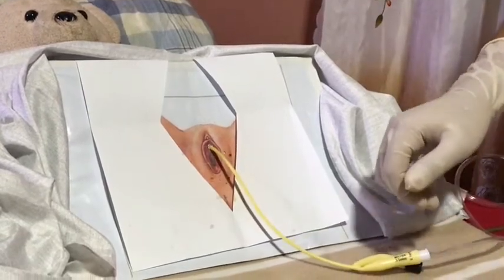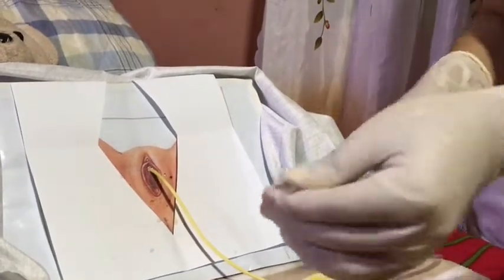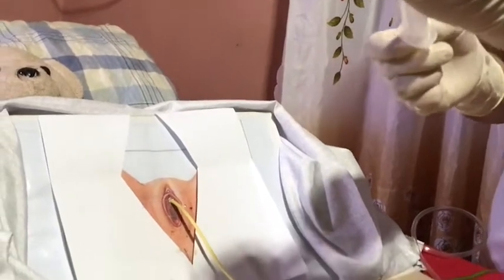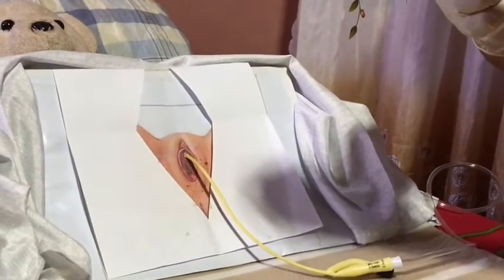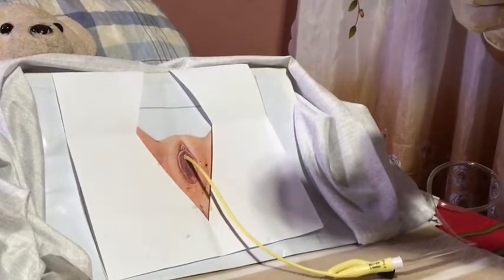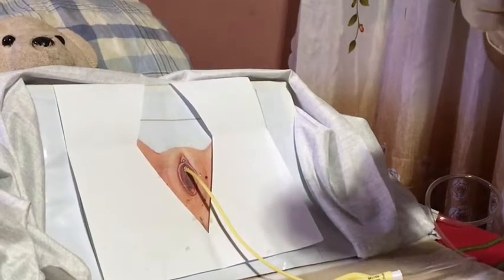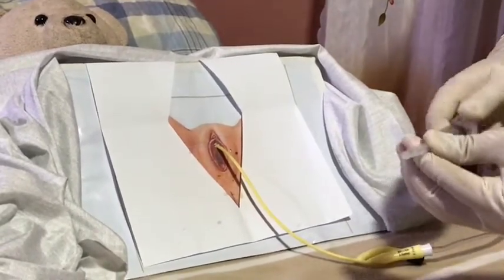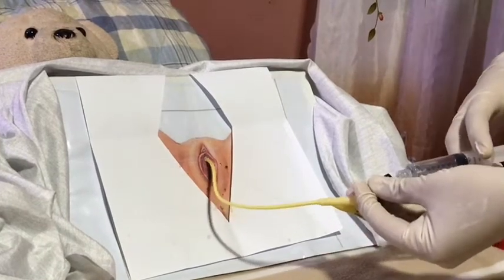Now inflate the balloon using 10 cc of sterile water using a 10 cc syringe. Now inflate the balloon with the sterile water.